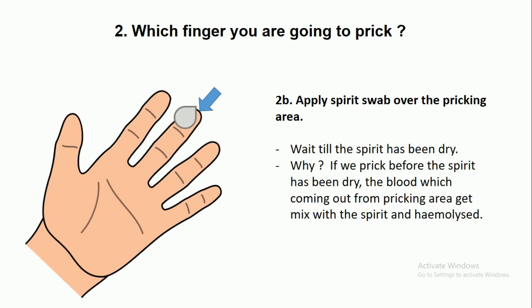Apply a spirit swab over the pricking area and wait until the spirit has dried. Why do we wait until the spirit has dried? If we prick before the spirit has dried, the blood coming out from the pricking area gets mixed with the spirit and becomes hemolyzed. So we need to wait until the spirit has dried.